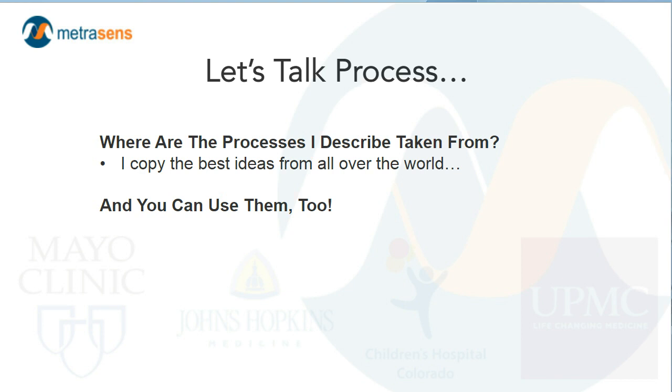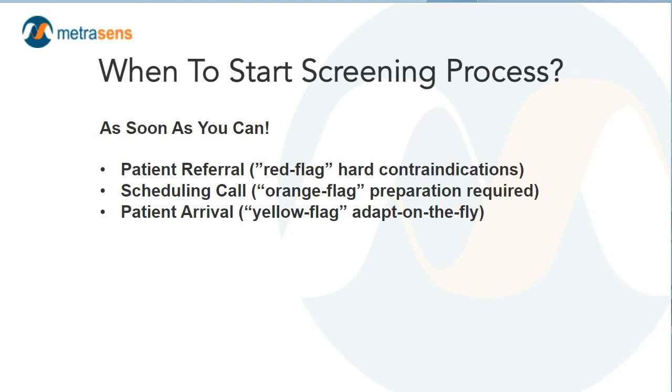Traditionally, MRI patient screening really began and ended on the day of the exam. We didn't know what we were going to get until they showed up. I would challenge you that just because that's the way it has been done doesn't mean it's the way it should be done. It certainly doesn't mean it's the best way.